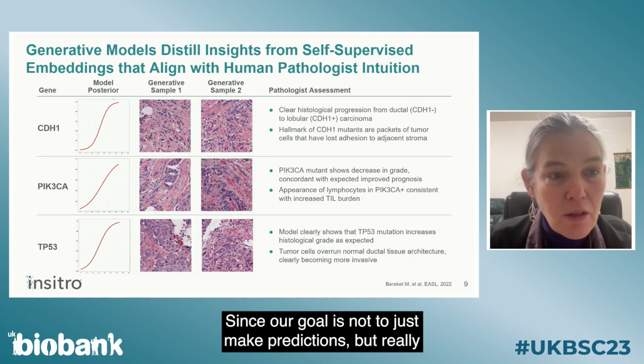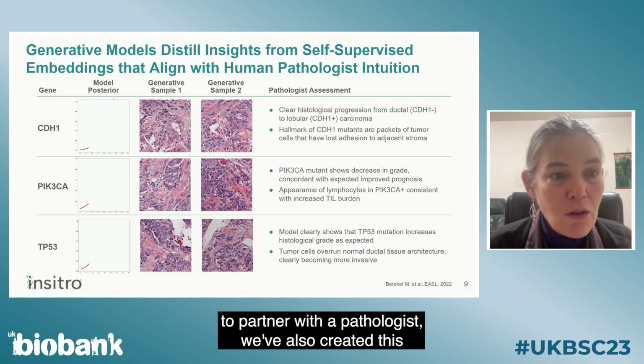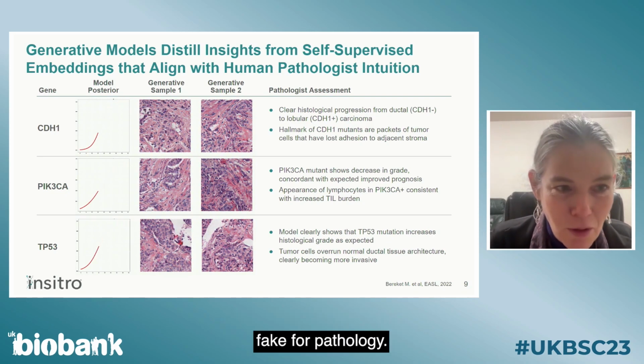Since our goal is not to just make predictions, but really to partner with a pathologist, we've also created this visualization, which you can think of as a deep fake for pathology.